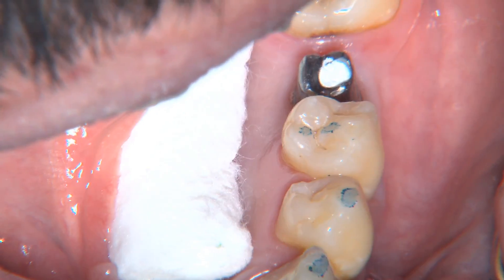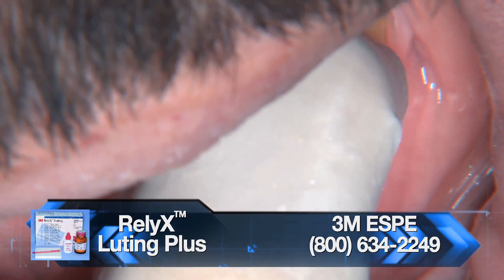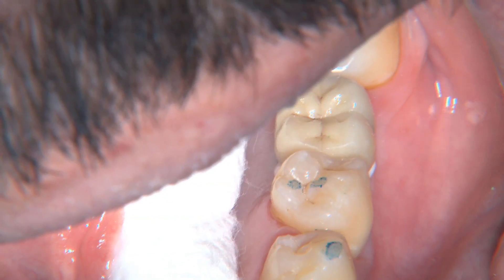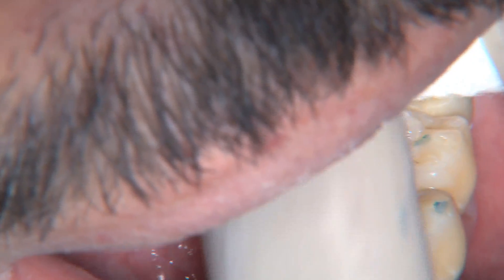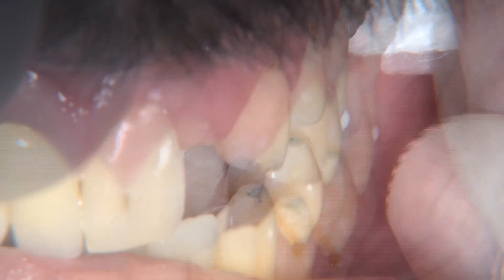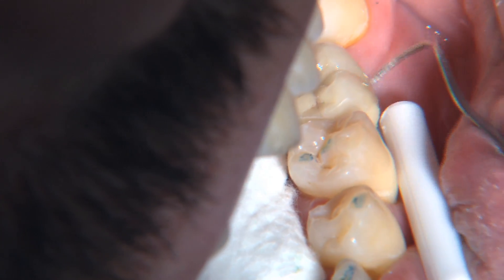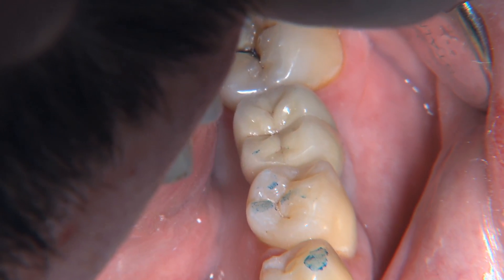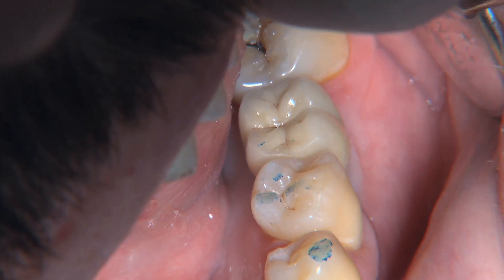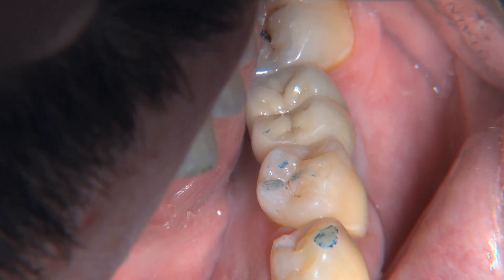We're putting a thin layer of Reliax luting cement — our typical crown and bridge cement — around the gingival third. Unlike a regular crown with die spacer on the prep, there's not as much room for cement here; you just need to coat the gingival third given the excellent mechanical retention. Cleaning off the excess cement is really important. It's important on all teeth, but on an implant crown you must get all that cement off — a low-grade infection around the implant is a great way to lose it.